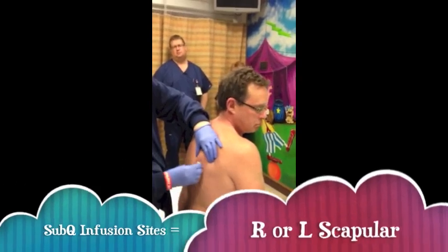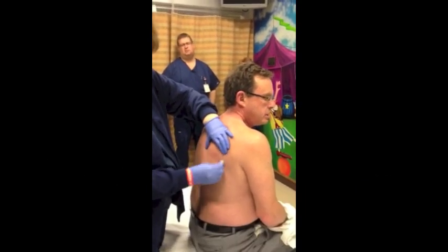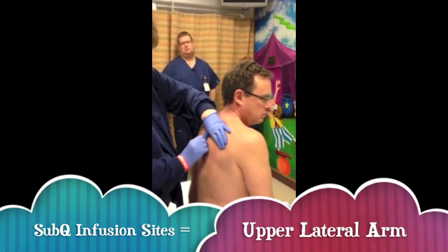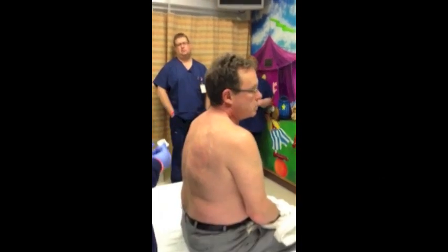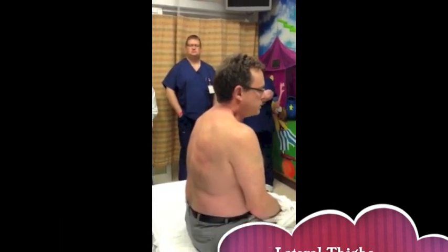It can be either side where I can pinch an inch. The scapular area, sides of the arm, sides of the legs — anywhere you can pinch an inch. They don't like the abdomen because the kids could play with it there.